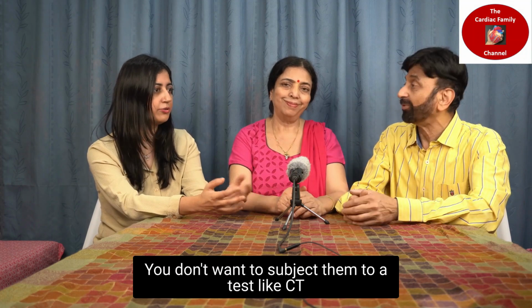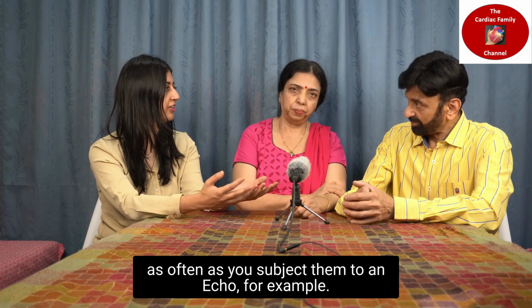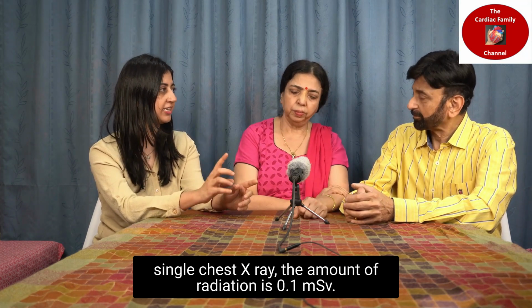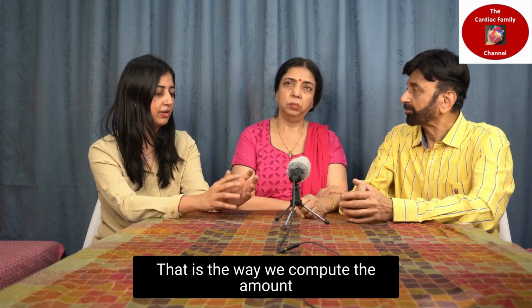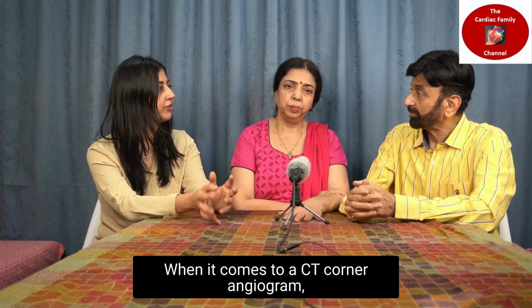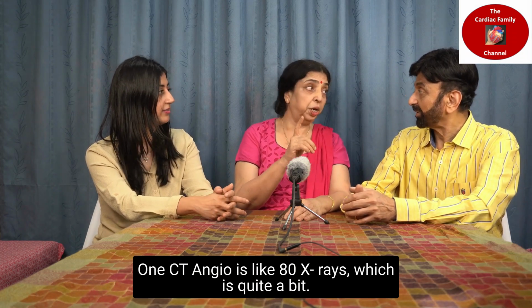Radiation in this case? You don't want to subject them to a test like CT as often as you subject them to an echo, for example. So how much radiation is there? For example, a single chest X-ray is 0.1 millisieverts. That is the unit we use to compute the amount of radiation someone receives. When it comes to a CT coronary angiogram, it is 8 millisieverts. So it's like taking 80 X-rays. CT angio is 80 X-rays.